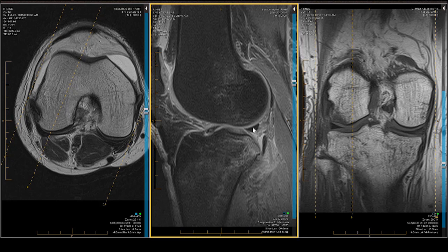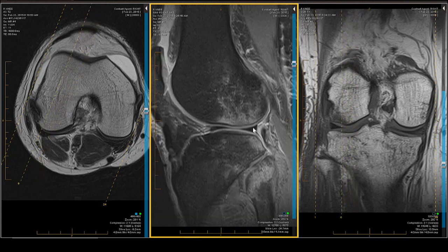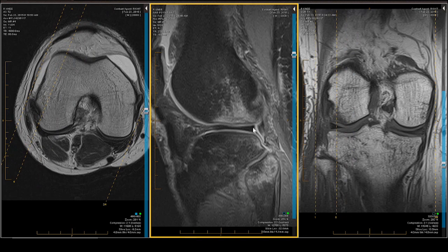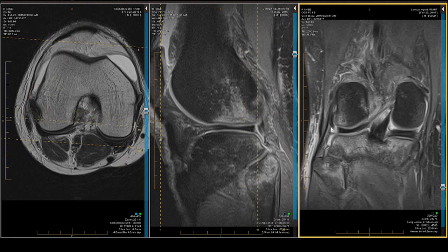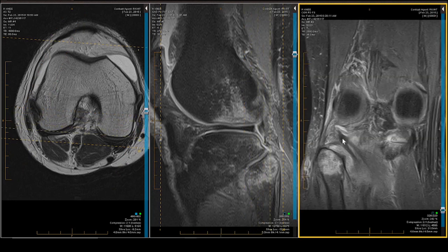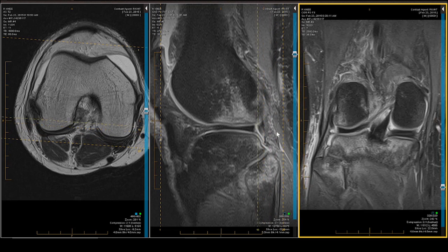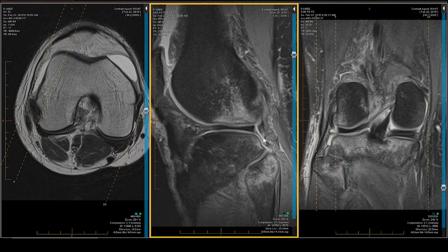We've got much bigger fish to fry in this case. Let's look at the popliteofibular ligament and popliteus tendon, perhaps best seen coronally. There it is in the hiatus — following it down, there's its arcuate course as it plunges inferiorly, anteriorly, and medially. It is intact, so we can clear the popliteus, but not the popliteofibular ligament.